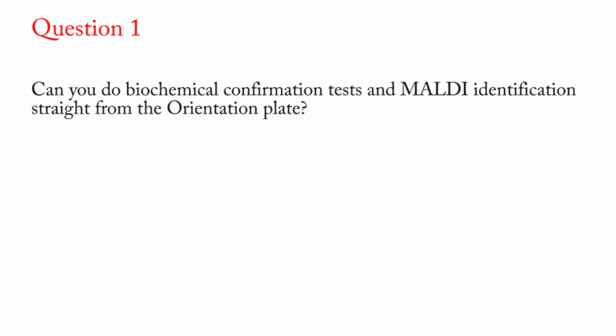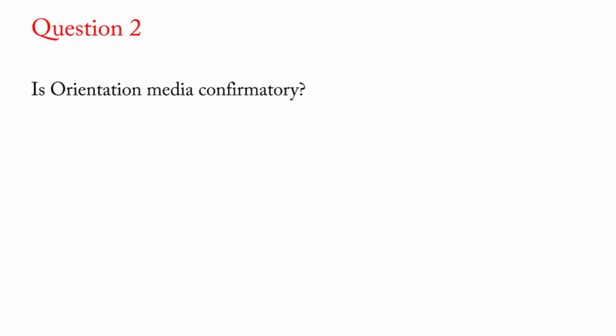Question 1. Can you do biochemical confirmation tests and MALDI ID straight from the orientation plate? Yes. Published scientific studies have shown that you can transfer colonies directly to MALDI-TOF from the orientation plate without any interference.